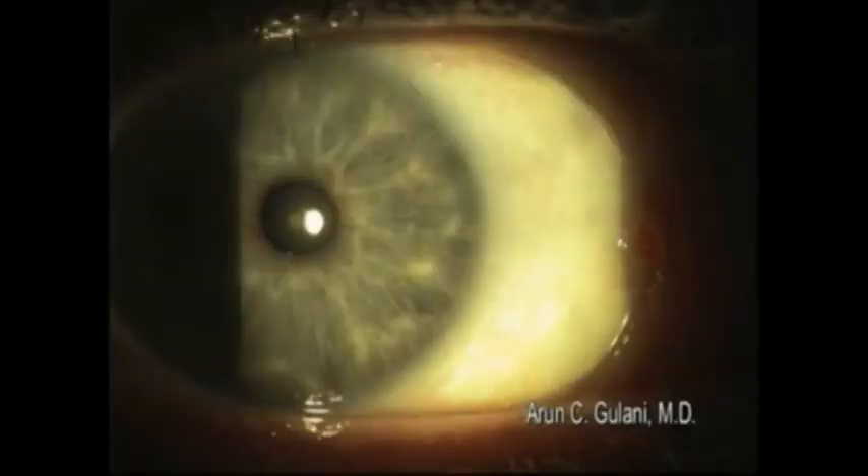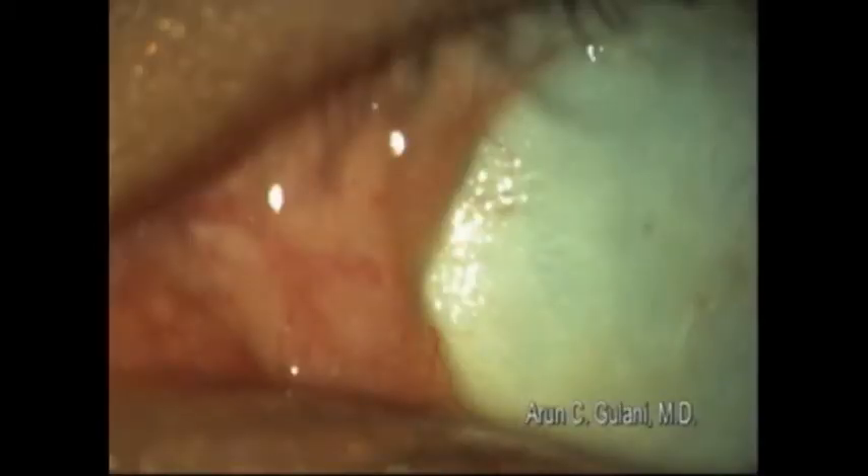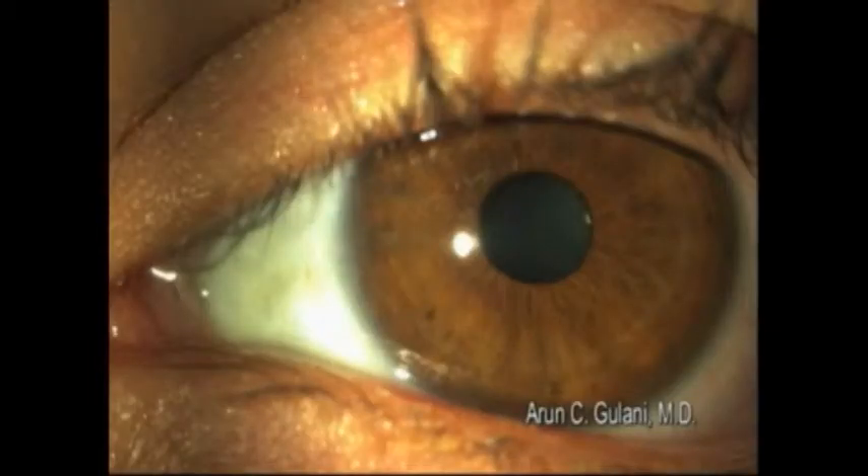Pre-op pterygium, post-op appearance, high magnification picture showing the amniotic membrane in place, well-adhered with the glue, and next day appearance of these patients.